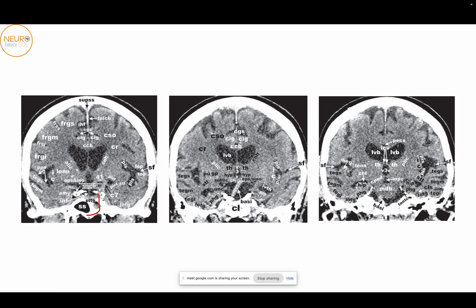As we go more and more posterior, the sphenoid sinus is starting to end, above which we have the pituitary gland — this is the sella with the infundibulum and the hypothalamus above it. On either side is the ICA, which is slightly atherosclerotic and calcified. As you go more posteriorly, the lateral ventricle will start turning into the atrium on both sides. The corpus callosum forms the roof of the lateral ventricle body. Above the corpus callosum you have the cingulate gyrus on both sides, above which you'll have the cingulate sulcus. The centrum semiovale, which is the frontoparietal white matter, at the level of the lateral ventricles forms the corona radiata.